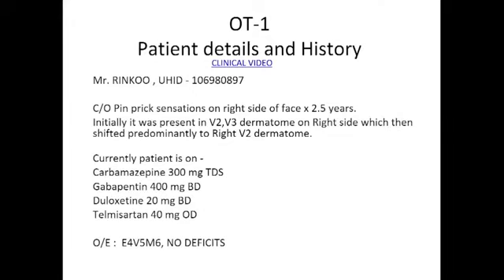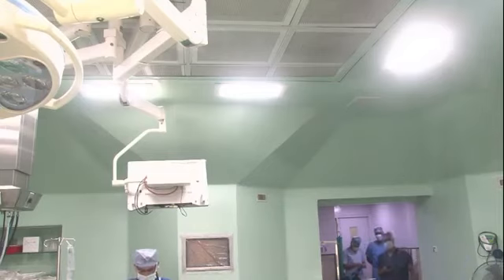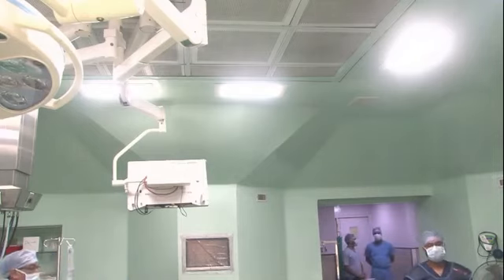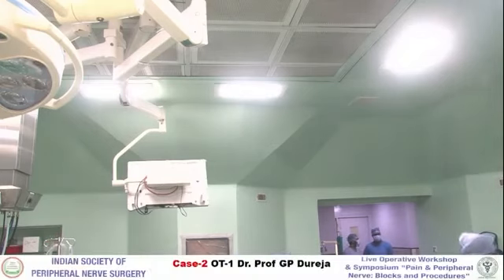Okay. X-ray please. Why this X-ray again, sir? Okay. X-ray please. Looks pretty good to me. Are you able to appreciate all of it? Yes. So I fired the stimulation at 0.5.